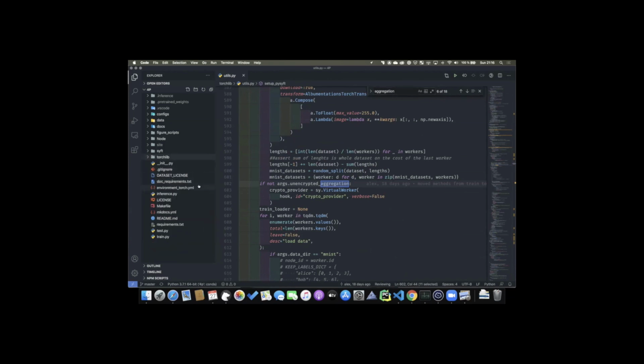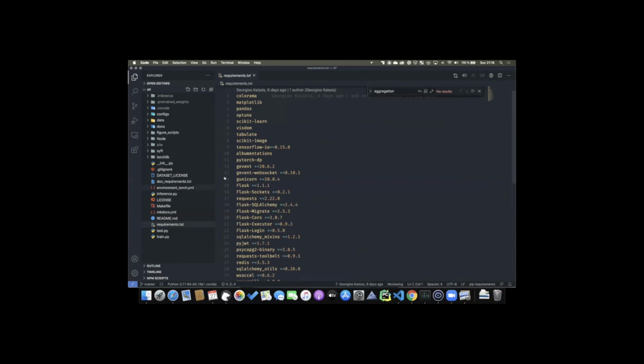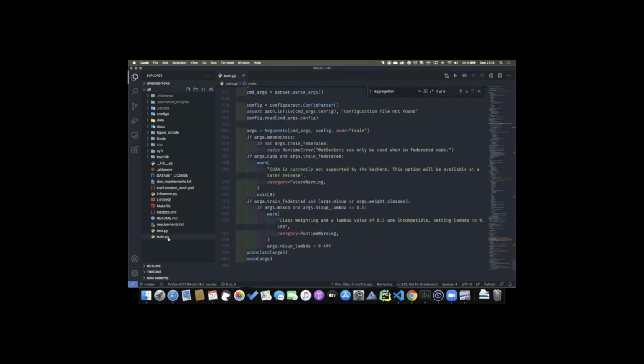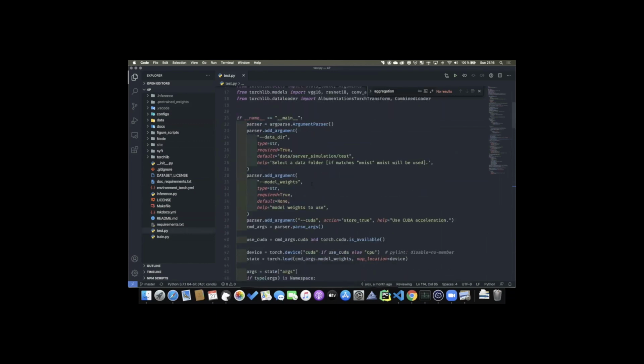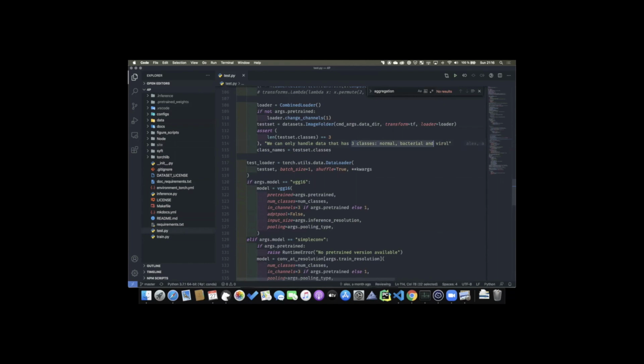Moving on, there are 2 environment files, which I'll show you how to use. There's the Conda one, and there is one for pip. So you can use it with pip or with Conda, although we suggest using Conda. And then there's the main scripts for using PriMIA for doing training and inference. One's called, aptly, train.py, and the other one's called inference.py. And if you use our data and the same data set, you can also use test.py, which is basically just to test if your model is any good, provided that the data is exactly the same data that we used. So this is sort of the high-level overview of the library.